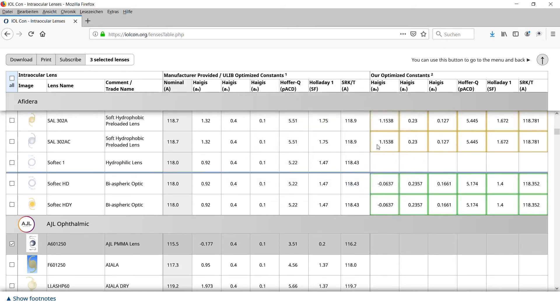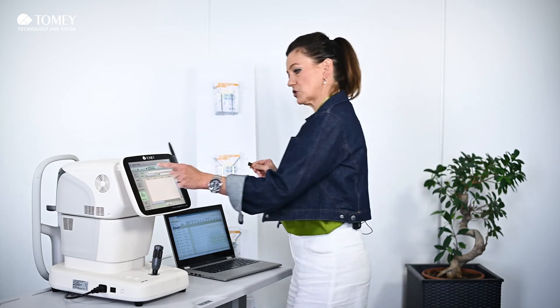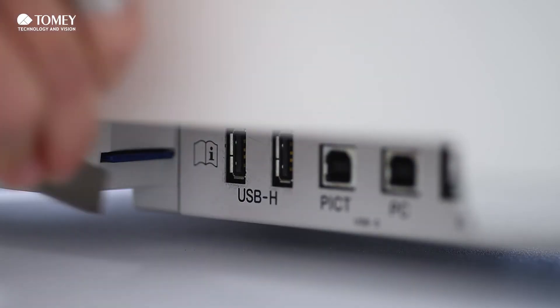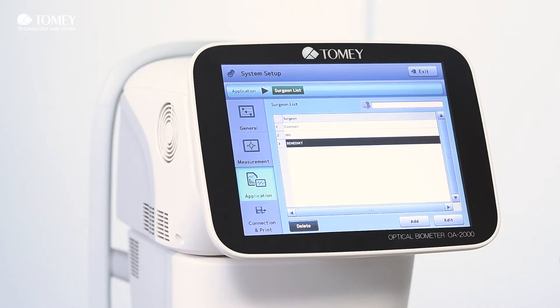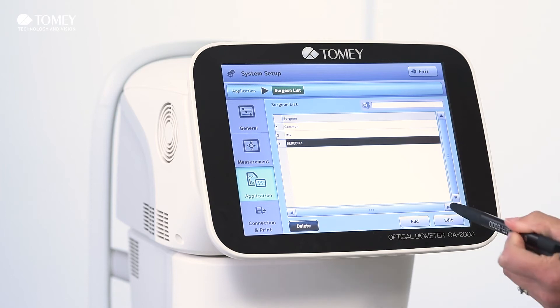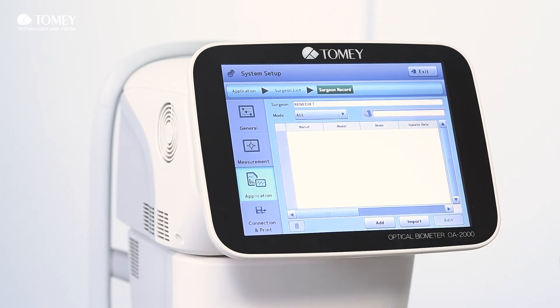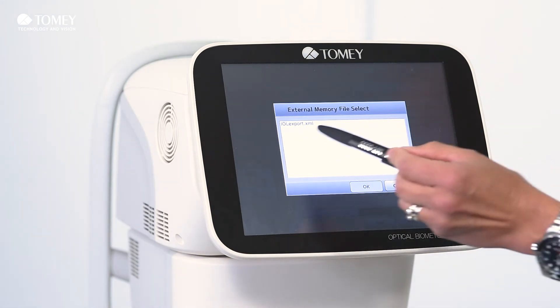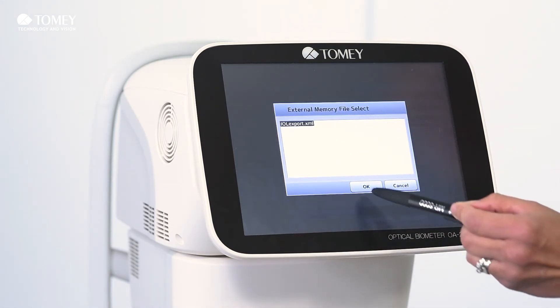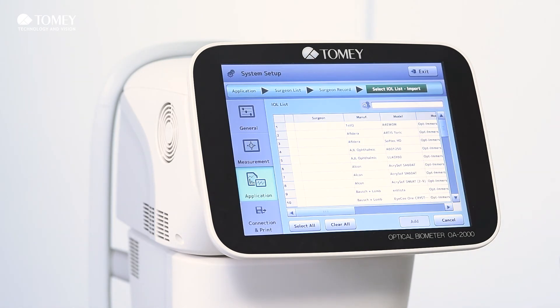Up to 60 IOLs can be stored in our OA, and after this you take the USB stick out of the laptop and put it into our system. Wait for some seconds so the stick is recognized — you will see a "please wait" message — then go on edit and the import button will now be active. When you click on the import button, you can see the IOL export data as an XML file; click on it, say okay, and then the data has been loaded.